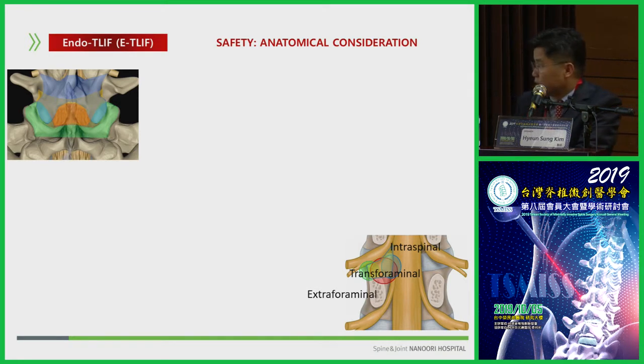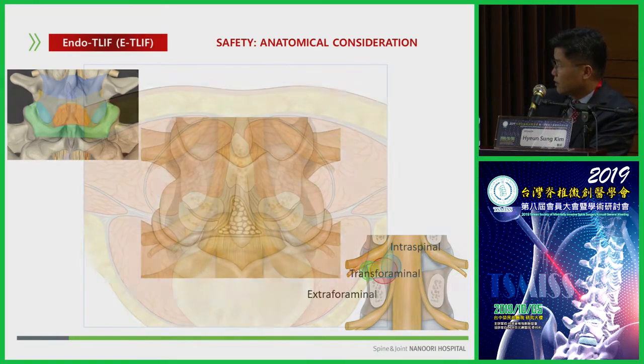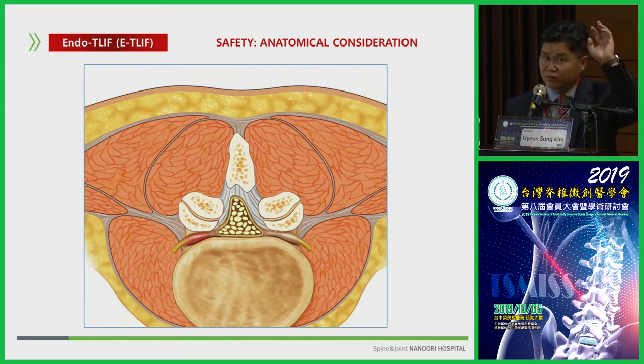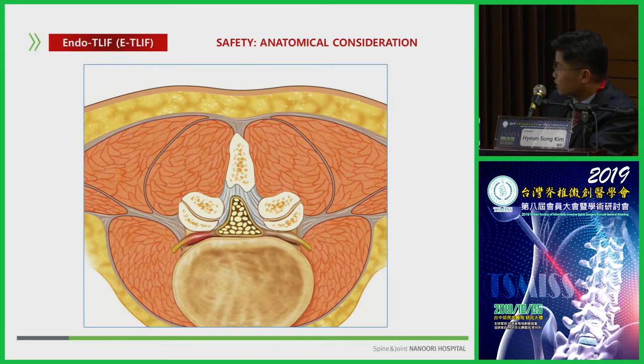Actually, using Kambin's triangle is an extraforaminal approach, and through the transforaminal approach will be the real transforaminal approach. But we should consider that, as I already mentioned, to realize endoscopic spine surgery, fusion surgery is also the same. First, we seek safety and success. Because of that, we should check here.